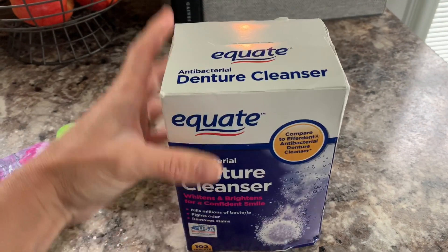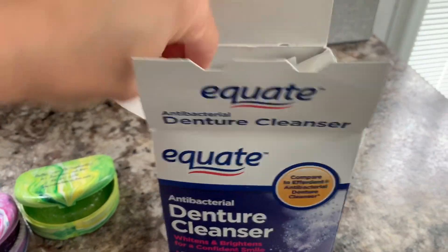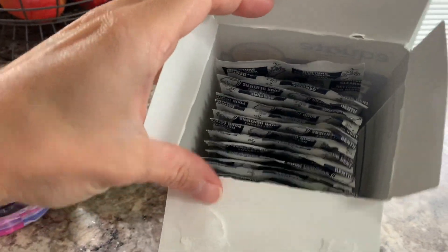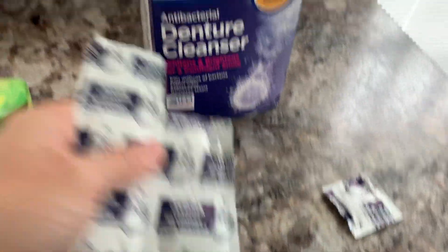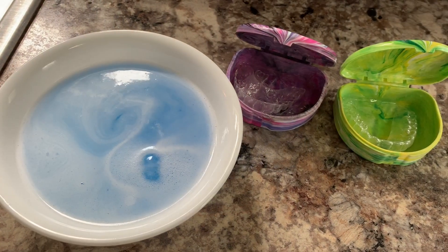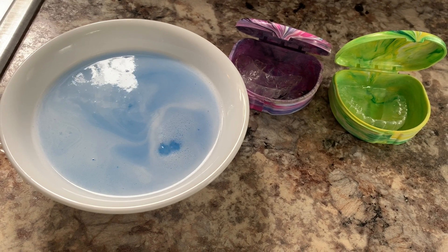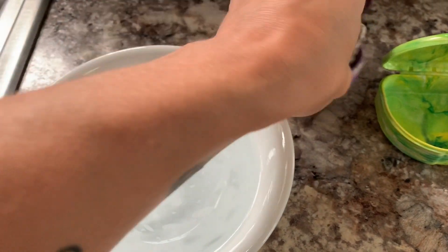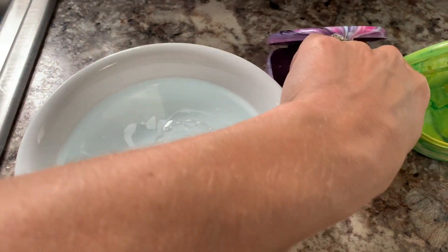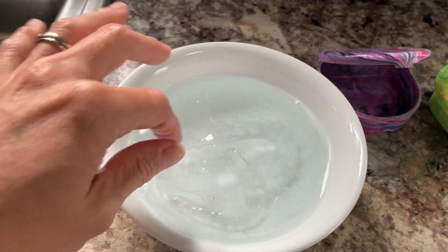I actually prefer white and I'll show you why here soon. You're going to need some denture cleanser — I've had this for about two years, it'll last you a long time. I only do this about once every few months. Take one of these tabs, break it off, put the rest back, and add it to a bowl of warm water. The warm water helps dissolve the tablet. Check your water periodically — you'll know it's ready because it'll go from blue to clear. Don't put your retainers in when the water is too hot, as it can damage them.